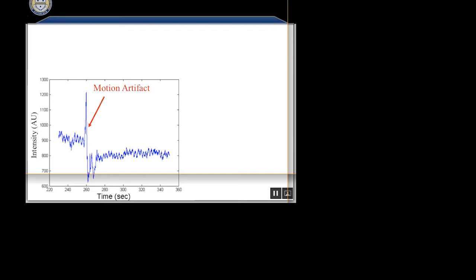The probe remains fixed. As long as it remains fixed, I can dance, I can do Nintendo, whatever. But as soon as that probe starts sliding on the head, the light that's going through the tissue is orders of magnitude weaker than the light that's just bouncing off the surface. And so if it lifts off even transiently, you're going to flood the detectors with an order of magnitude change in light. And that's why you get these huge spikes like this.